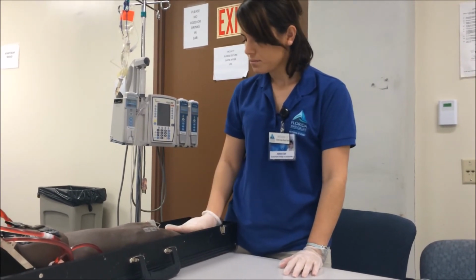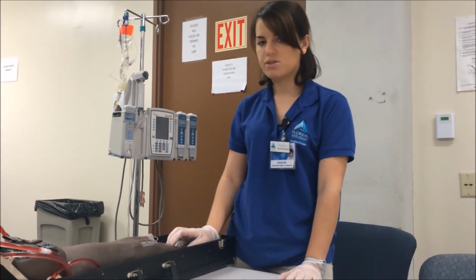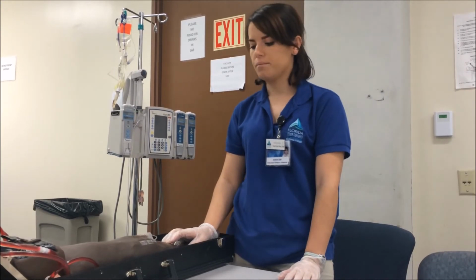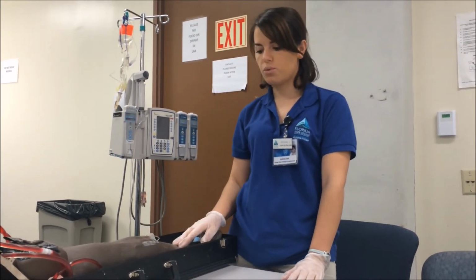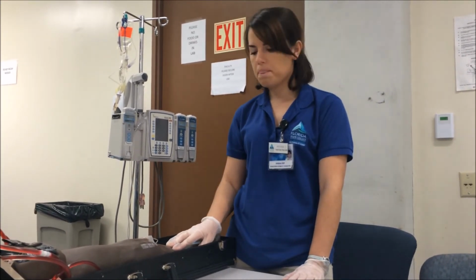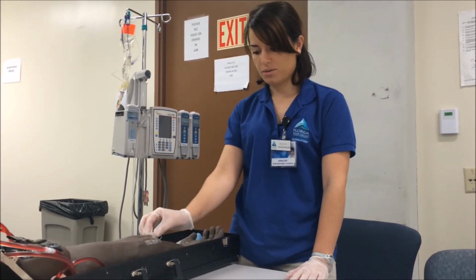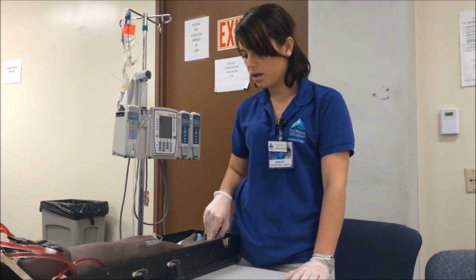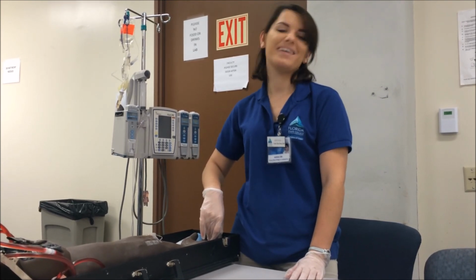And now I'll move on to documentation, and I will document the time, the drug, the dose and the route, and then also document the site of the IV insertion, which was no redness or swelling or infiltration, and the intake and output, and also how my patient tolerated the procedure, and I believe my patient tolerated the procedure well, and I believe that completes the IV piggyback.